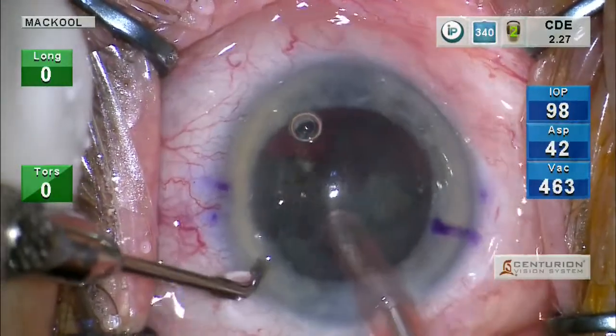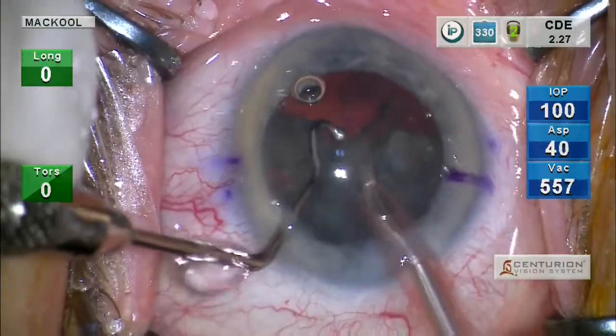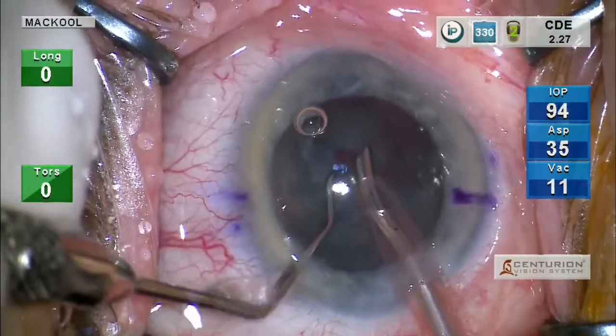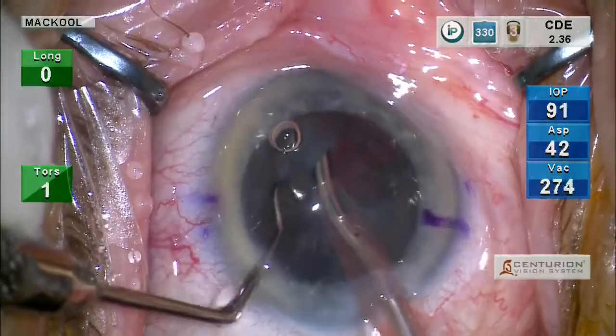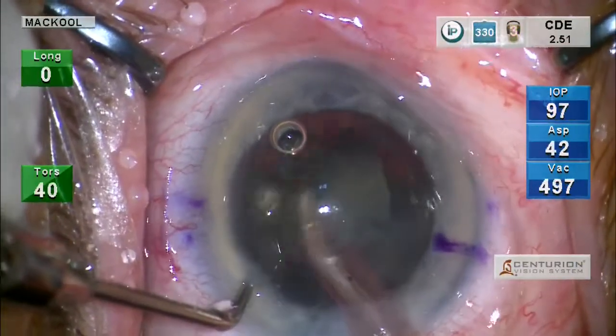I take some epinucleus here. Even that gives me more space to rotate smaller chunks of nucleus. And again, with the cornea, keeping them away from the endothelium.